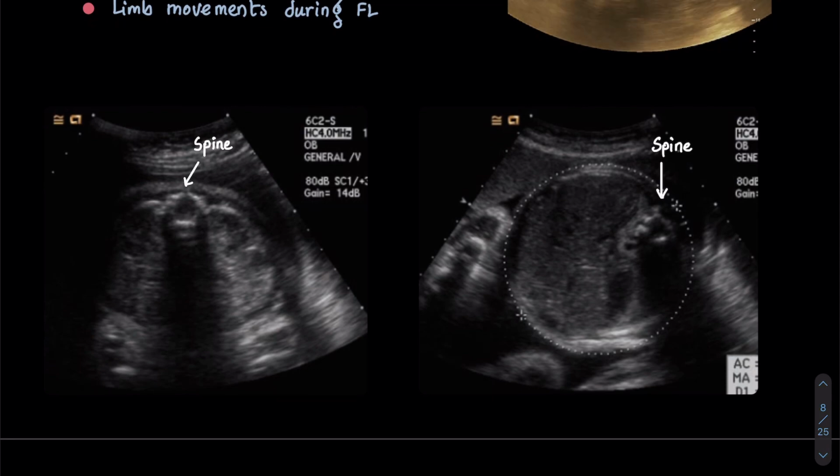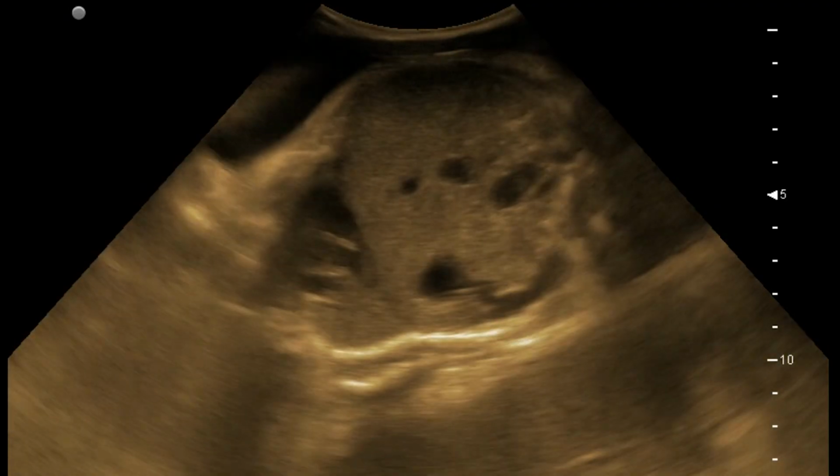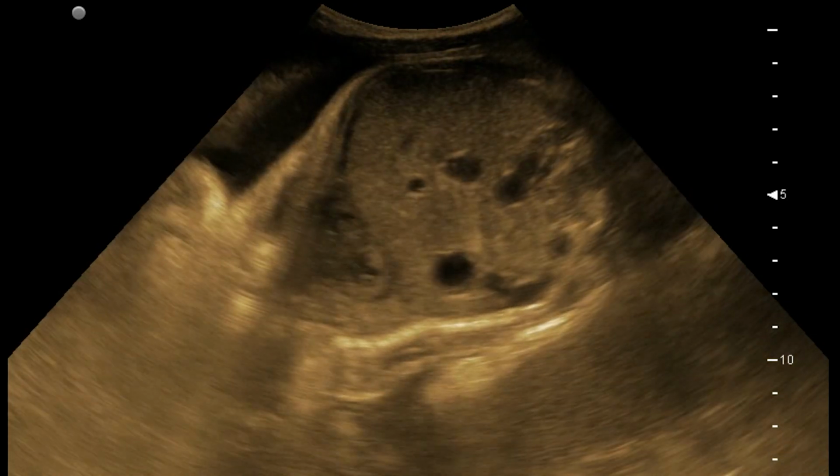You can see the cross-section of the abdomen on the left. Spine is seen on the midline. The fetus moved and now you can see the spine at around 2 o'clock position. So you can count it as one gross body movement. Check on real time. Here you can see a good fetal trunk movement.